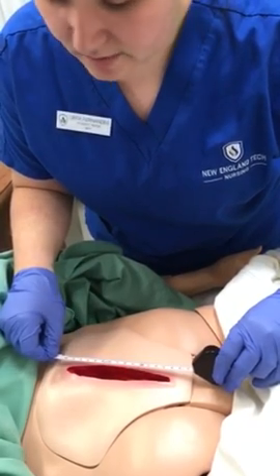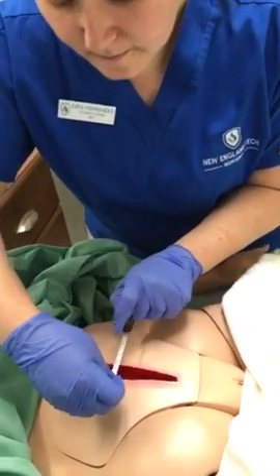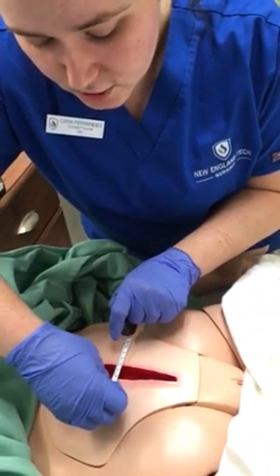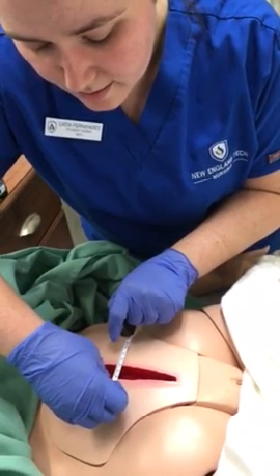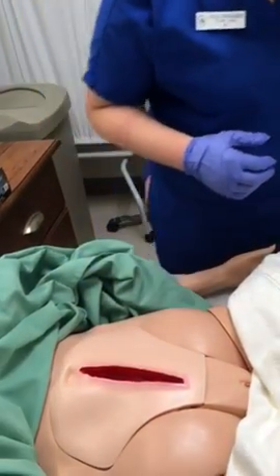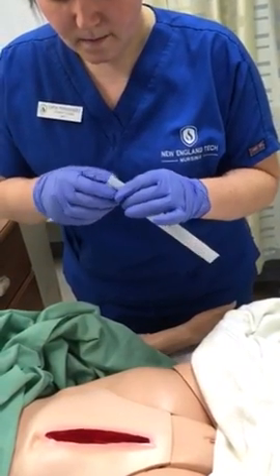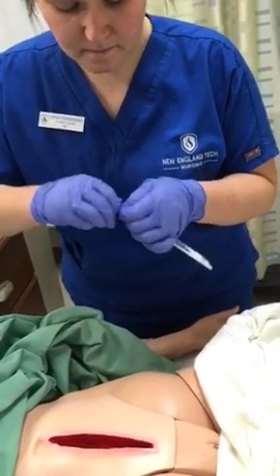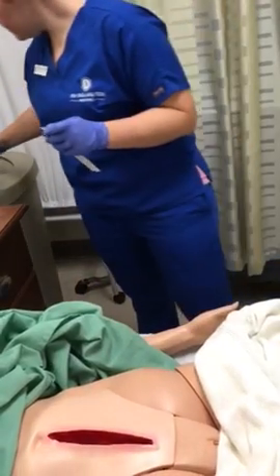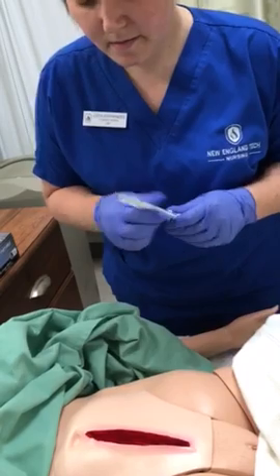Without touching the wound, this is approximately, it is 14 centimeters long. It is 2.5 centimeters wide. And now I'm going to go ahead and check the depth with this sterile cotton tipped applicator.